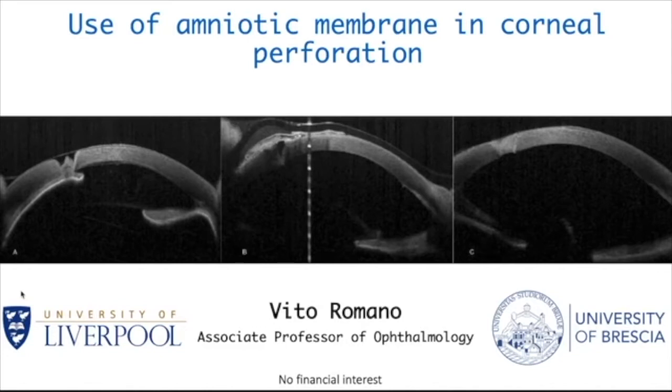But tonight I would like to highlight that the use of a dry amniotic membrane is a good tool that you can use at a slit lamp, making your life easier and with very good results.